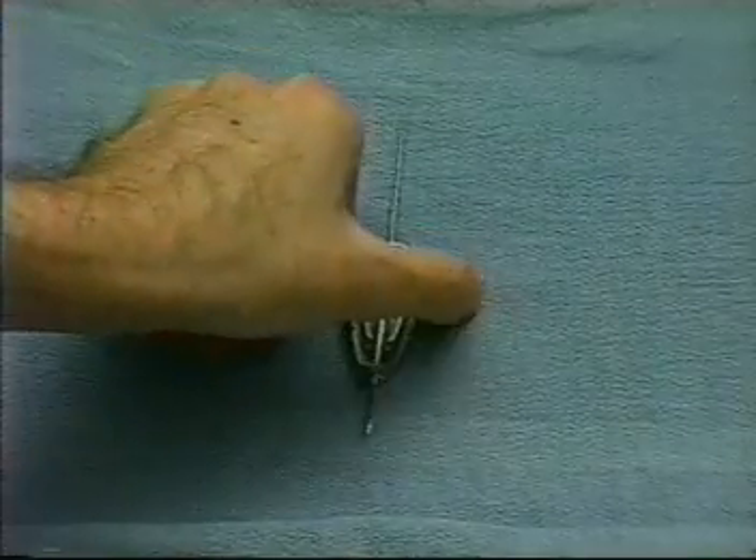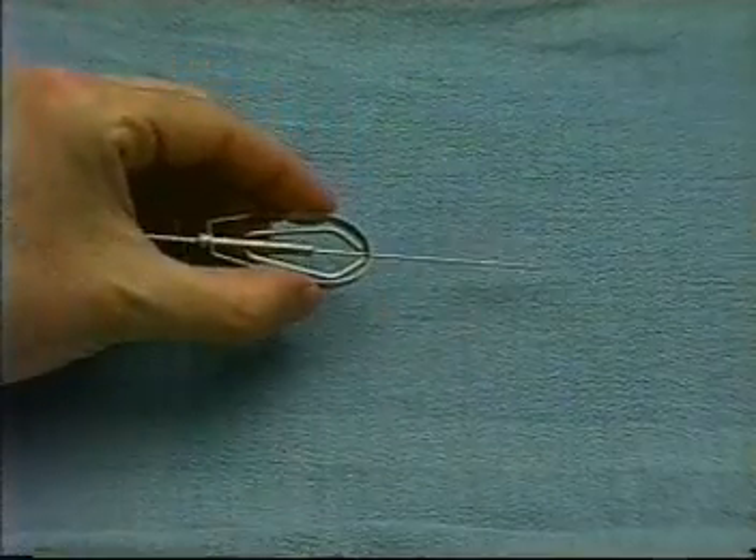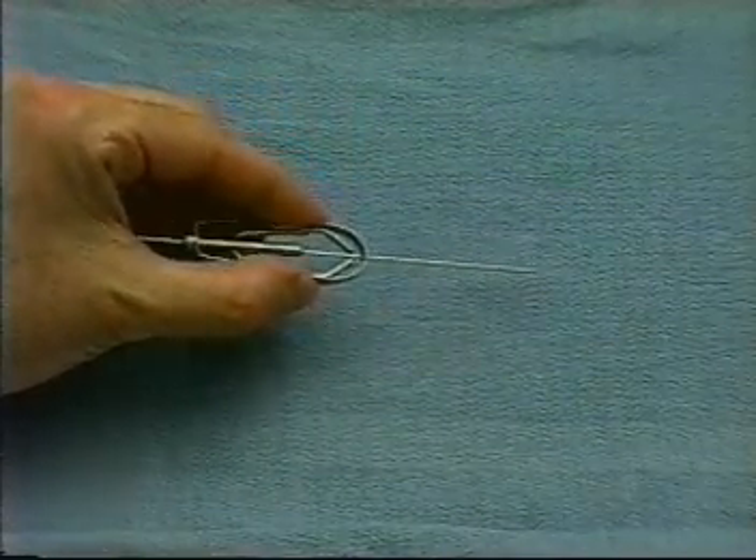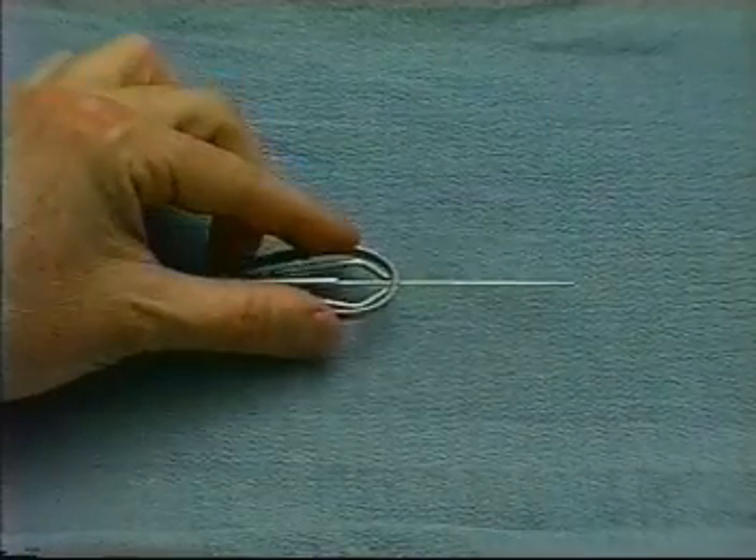Be sure to have available all necessary equipment, including the inserter, which we see here demonstrated. You must also have good lighting and magnifying loops, which are essential for this type of repair.